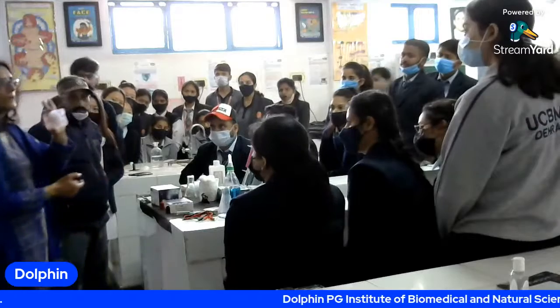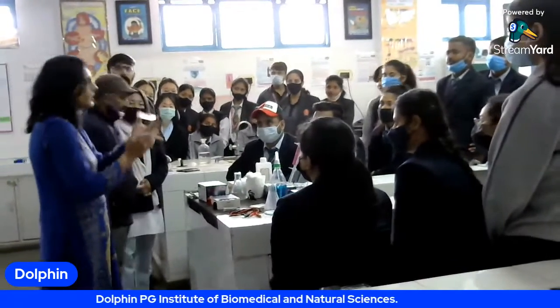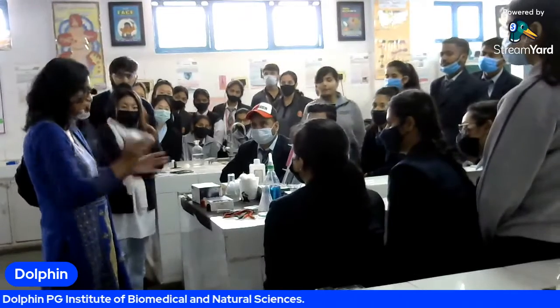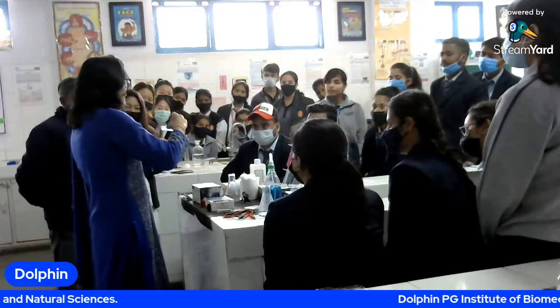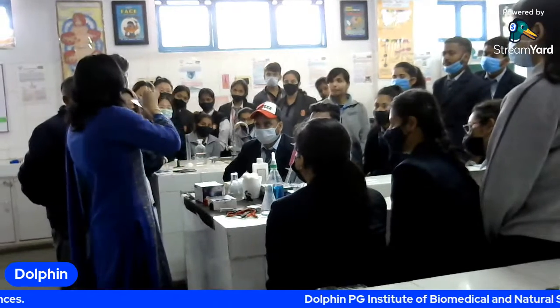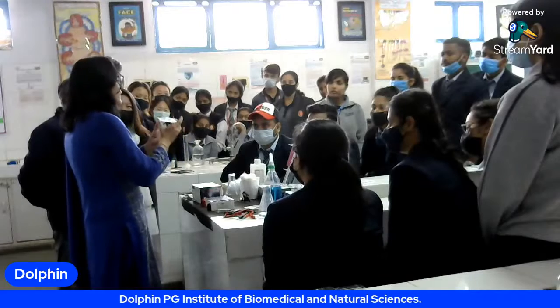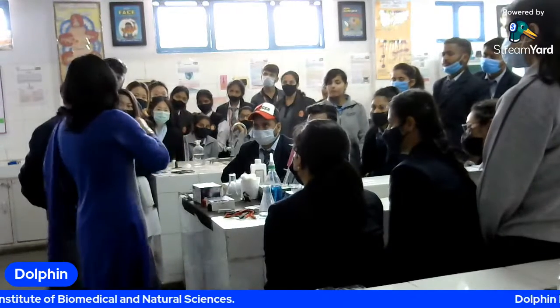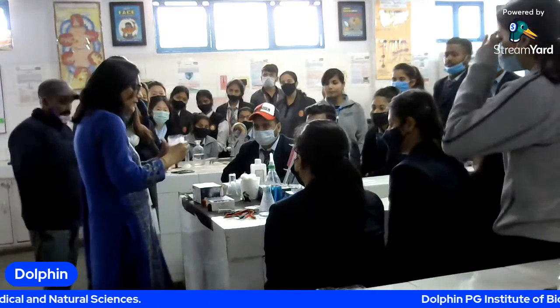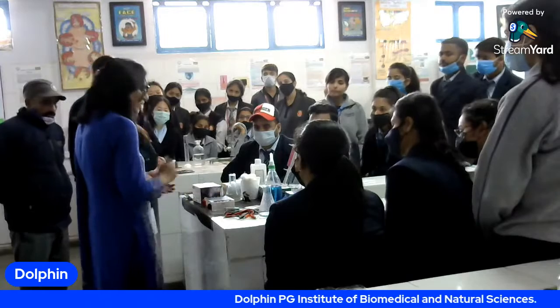This is the glass plate. Last time you have also used this glass plate. Now on this glass plate, first of all, we have made a kind of wall with tape. We have wrapped the tape on all sides so that when we pour the gel, it will not flow away. So this is the gel plate on which we will make the gel.